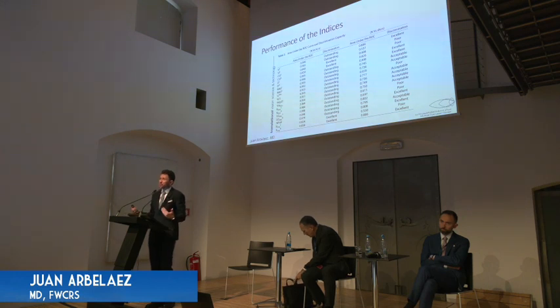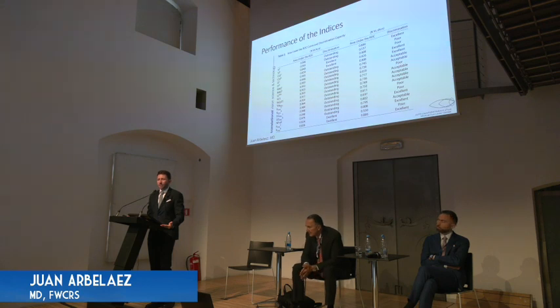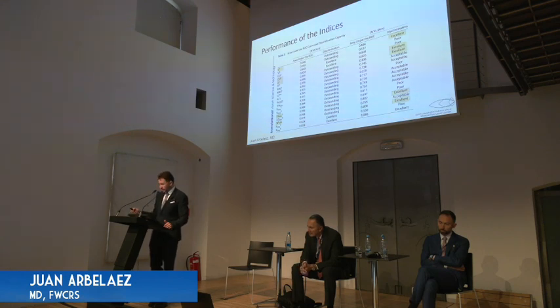That is what we want to do, to screen for suspect cases and not to perform LASIK or refractive lenticule extraction. So the indices that achieve excellent discrimination are the ones that are highlighted, and this is also in the paper that we published for the neural network.